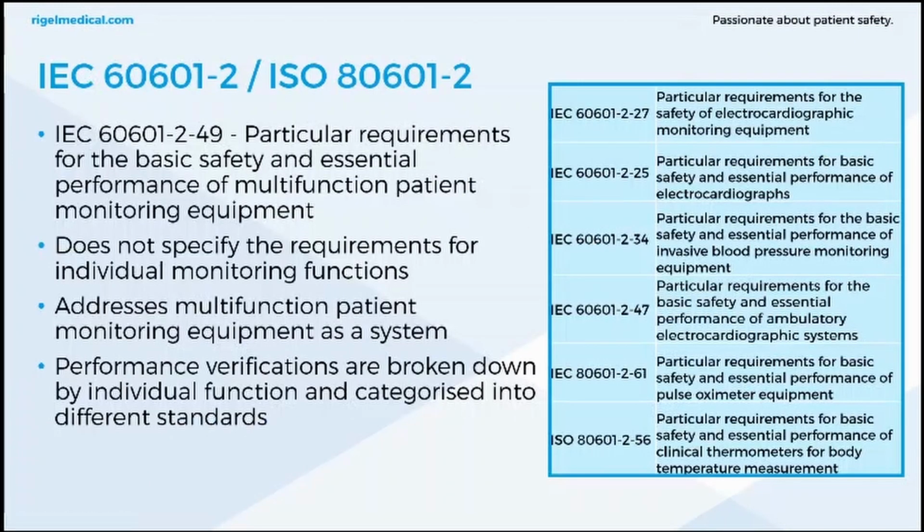Okay, so performance testing. Patient monitors are very comprehensive devices. They're multi-function monitoring equipment. So there's not just one standard that needs to be followed. It's not like other pieces of equipment that you'll find in healthcare. There's multiple standards that need to be followed.